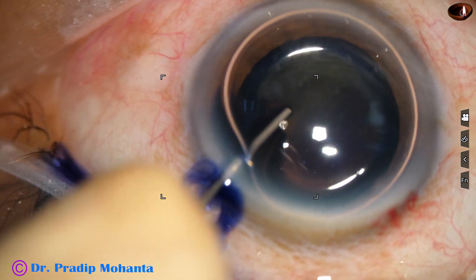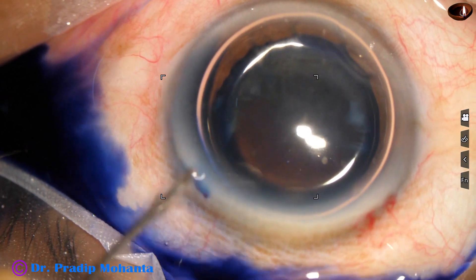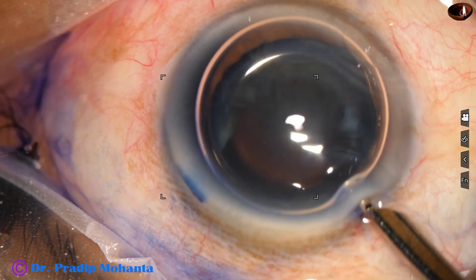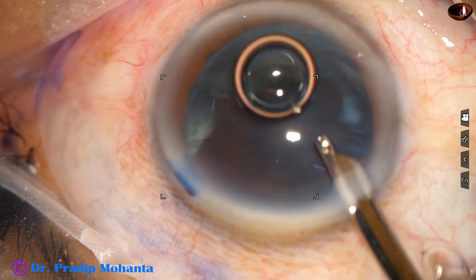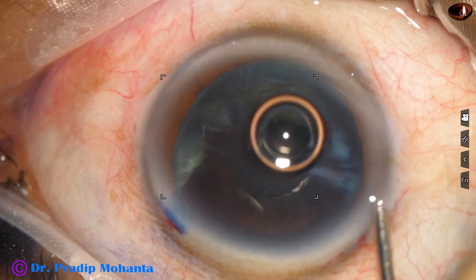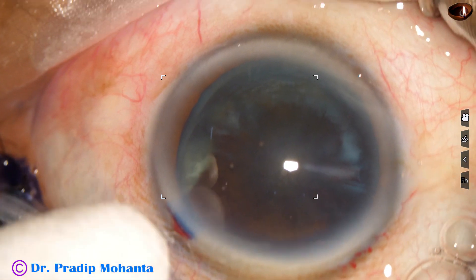Underneath this air bubble, trypan blue dye is applied over the anterior capsule. This is a bit of adrenalin. Now the dye is washed out. If we don't wash out the dye, there will be more concentration of dye in some areas and less concentration in others, and that causes some problems in visibility.